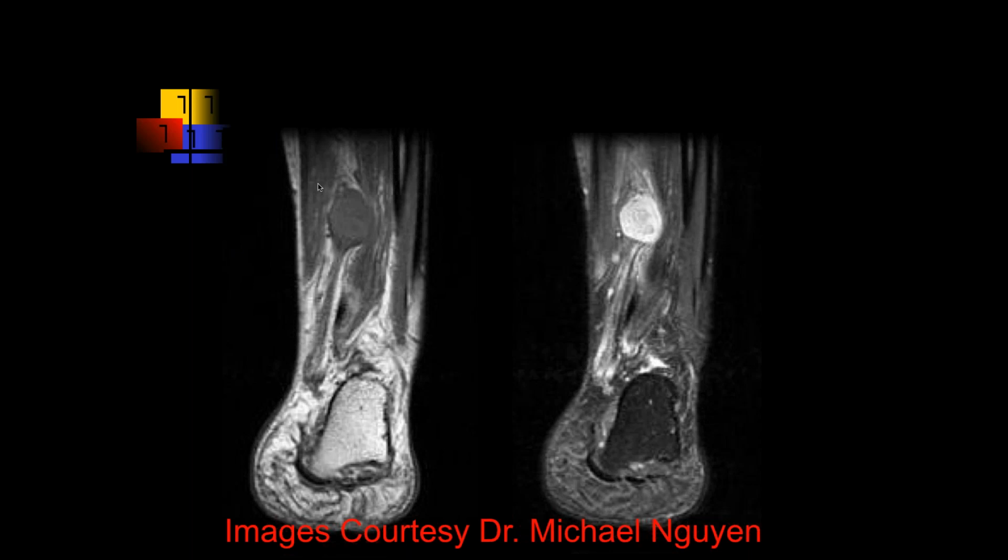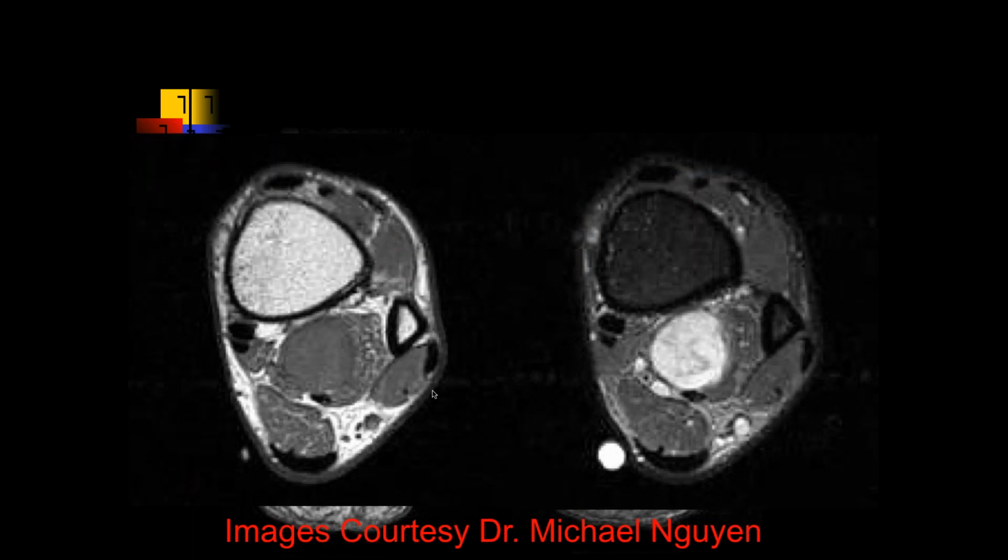And this kind of looks like a linear structure before it. If you had a couple of other images, there'd be a linear structure coming up out of it. Could be a neurofibroma. Now this is much better. On the axial images, where the flexor hallucis longus muscle is, there's a hyperintense, slightly heterogeneous lesion, which is adjacent to the neurovascular bundle. So here are the two veins and the artery.